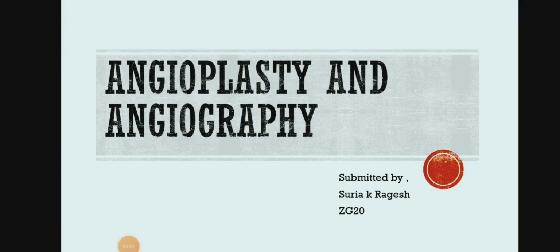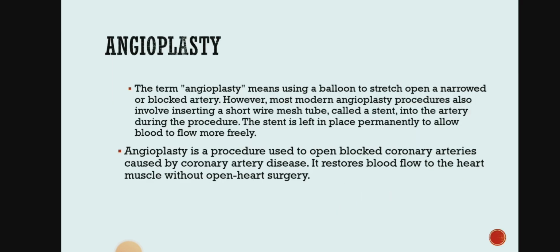Hi everyone. In this video we are going to study about angioplasty and angiography. So let's go. So what is angioplasty? Angioplasty is a medical technology used to unblock the blood vessels, most commonly coronary arteries.